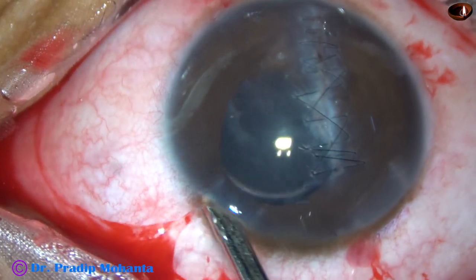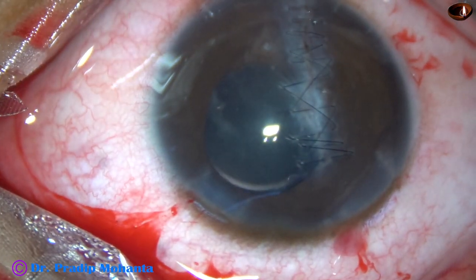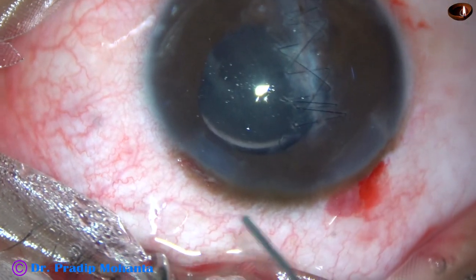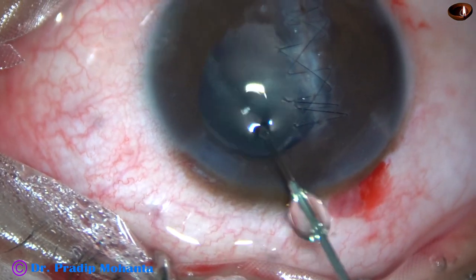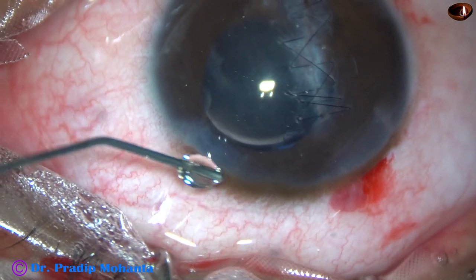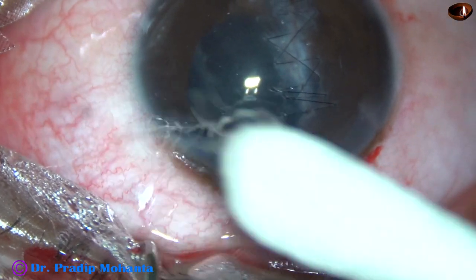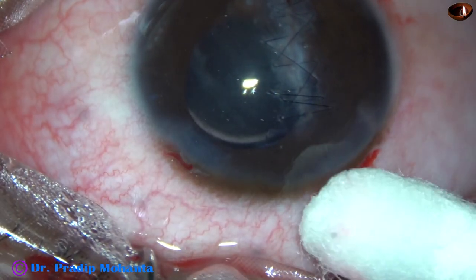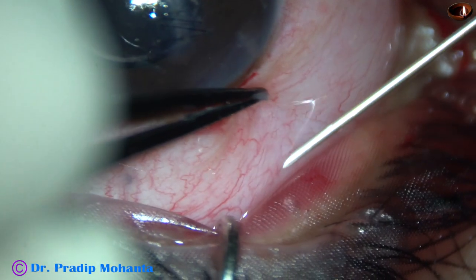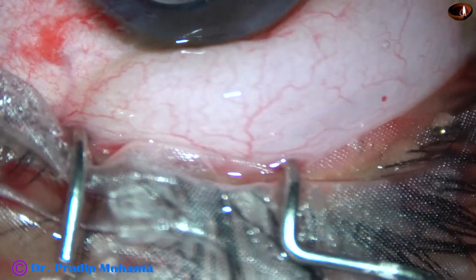The side port is made with a keratome, and when we make side ports with a keratome, most of the time it is self-sealing — you don't have to hydrate the side port if it is slightly larger than the instrument going in. A bit of moxifloxacin is applied as the last step. I find the anterior chamber is nicely formed and there is no leakage from any wound. As the final step, I inject about 0.3 ml of dexamethasone in the subconjunctival space.